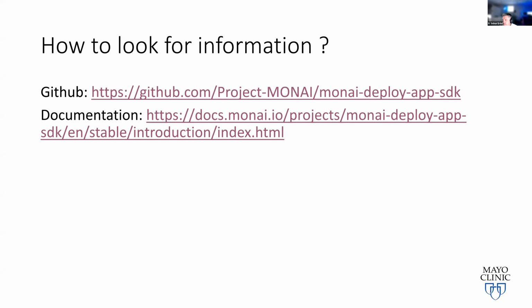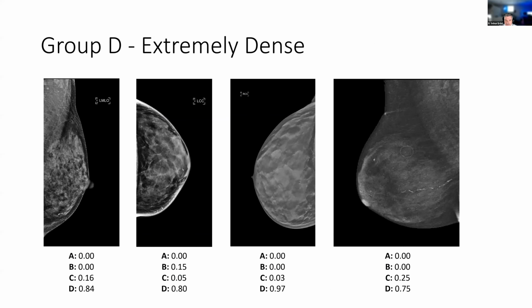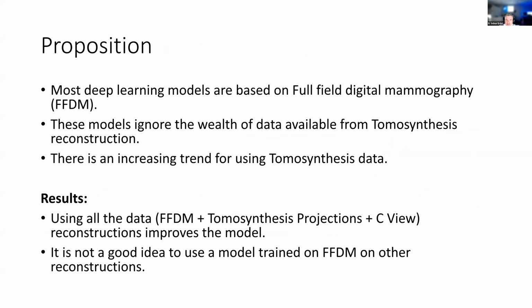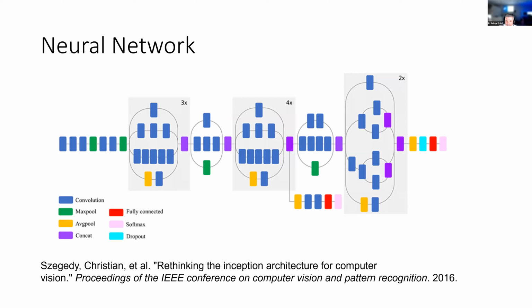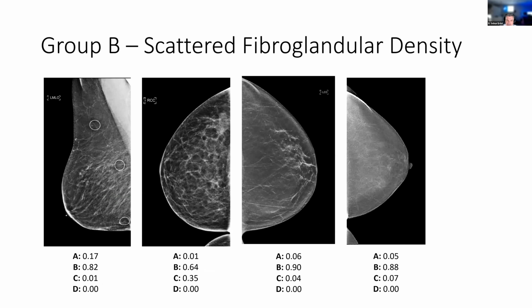Now, with all this in mind, I just want to give 2 minutes to this. On the MONAI Application Zoo, there are packages we built, and one of the examples is breast density classification. So you can download those packages. You don't have to even start from scratch to build an application. You can take a pre-built application, download it, and play with it. Trained, ready to go.